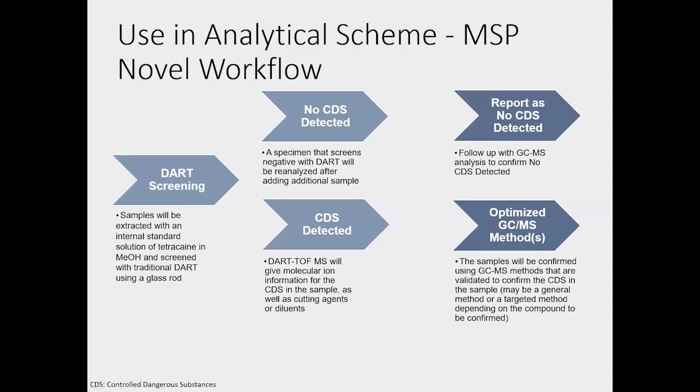Okay, so as part of the NIJ project, we were trying to figure out if bringing the DART in as a screening tool actually helped us improve our workflow at all.